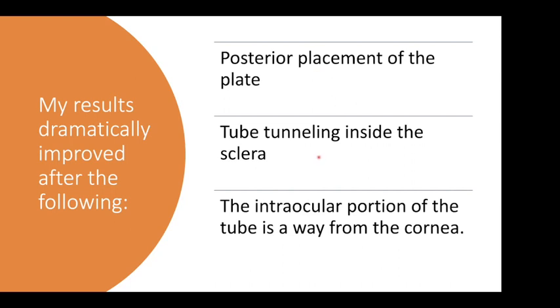Tunneling of the tube inside the sclera, so nowadays I don't see scleral tube erosions or exposure. Definitely, I don't know in the long term, like after 5 or 10 years, what will happen, but the tubes are really good inside the scleral tunnels. And the intraocular part of the tube is away from the cornea. I got some cases of cornea decompensation because the direction of the tube could be towards the cornea, but nowadays I make sure it's towards the iris or at least parallel to the iris.